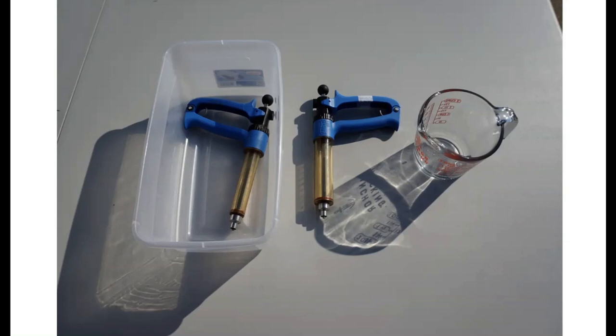After I do that, I'll put it in a plastic container till I get ready to use it the next time. Now, I think it's very important, if you do it this way, to put that plastic container in the freezer, okay? Because there's going to be a little bit of steam residue left in that barrel, and I don't want to just put it up in the cabinet. If you do that, you could get a little mold or mildew. By throwing it in the freezer, you don't have to worry about that. And that little bit of steam that stays in the barrel works perfect to lubricate the O-ring the next time. So we just throw them in that plastic container, and the container goes into the freezer till we get ready to work cattle again. Then just remember to pull it out of the freezer about an hour before, because you do need to let it thaw out.